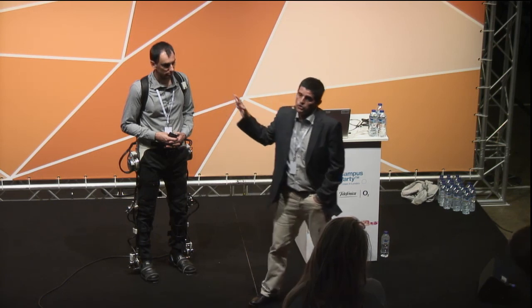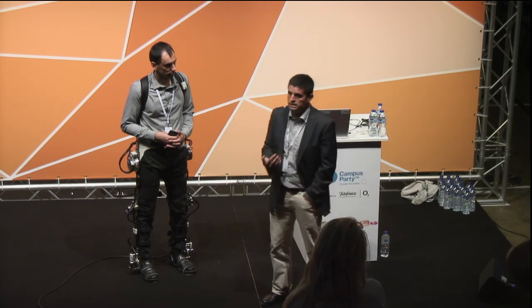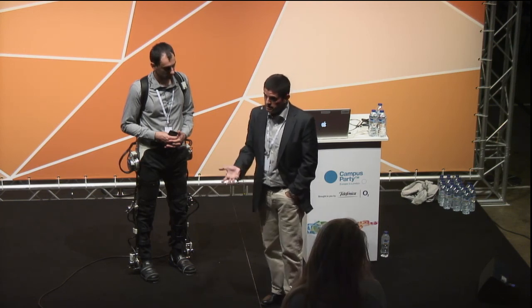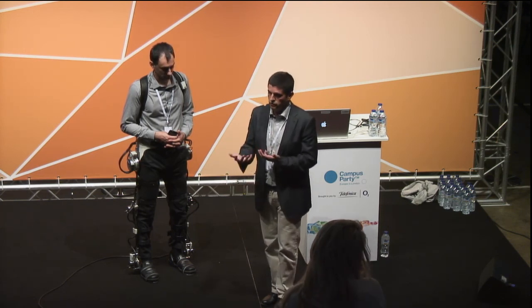But we can also use other strategies. So we could, for instance, use a resistive strategy where you impede the motion of a particular joint.